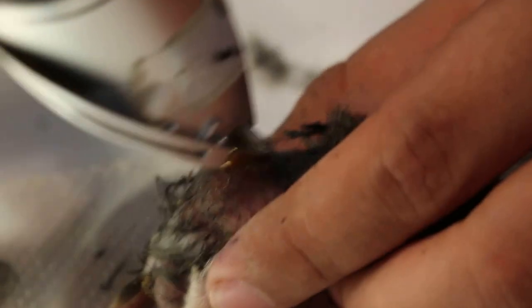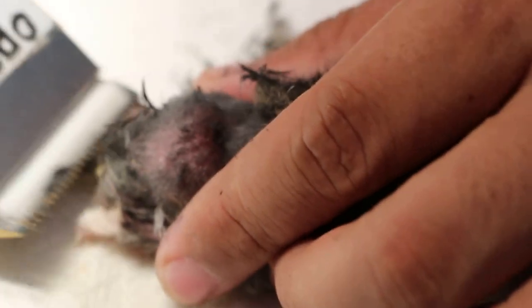I will just clean up. And then I will aspirate to check whether it's an abscess. There are some who want to do FNA — fine needle aspiration.